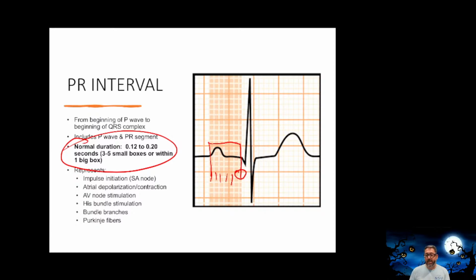It's going to be a mix. You're going to have just straight up 12 lead EKG, and that's to say, what is the rhythm? What is the MI? Or you'll have strips as well, just plain rhythm strip, and it'll just say, what's the rhythm? Those are going to be your blocks, your atrial and ventricular arrhythmias as well.